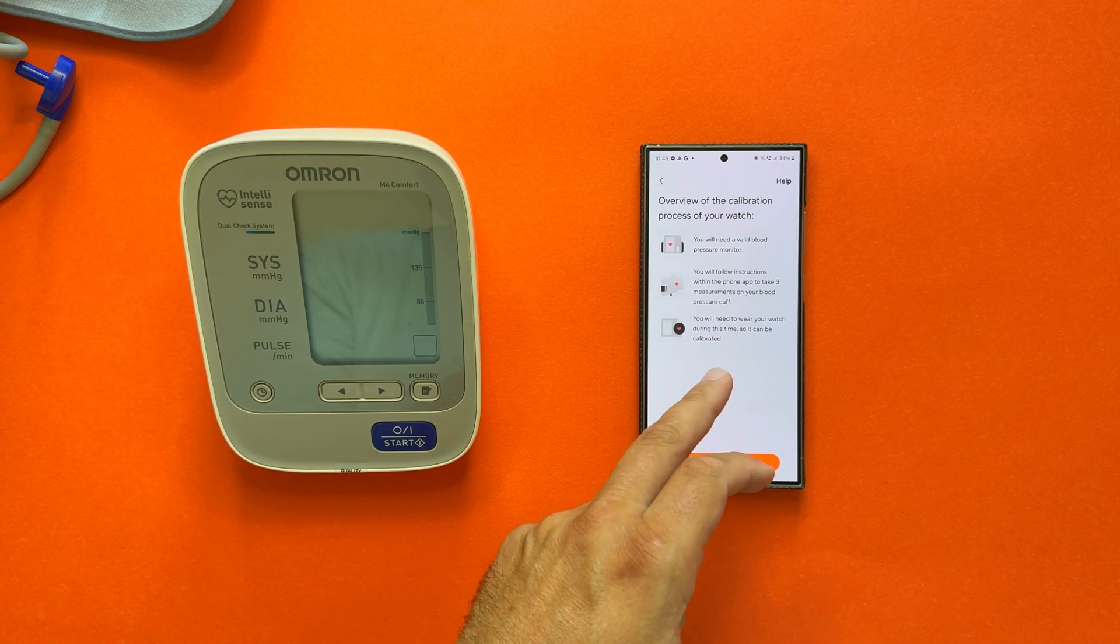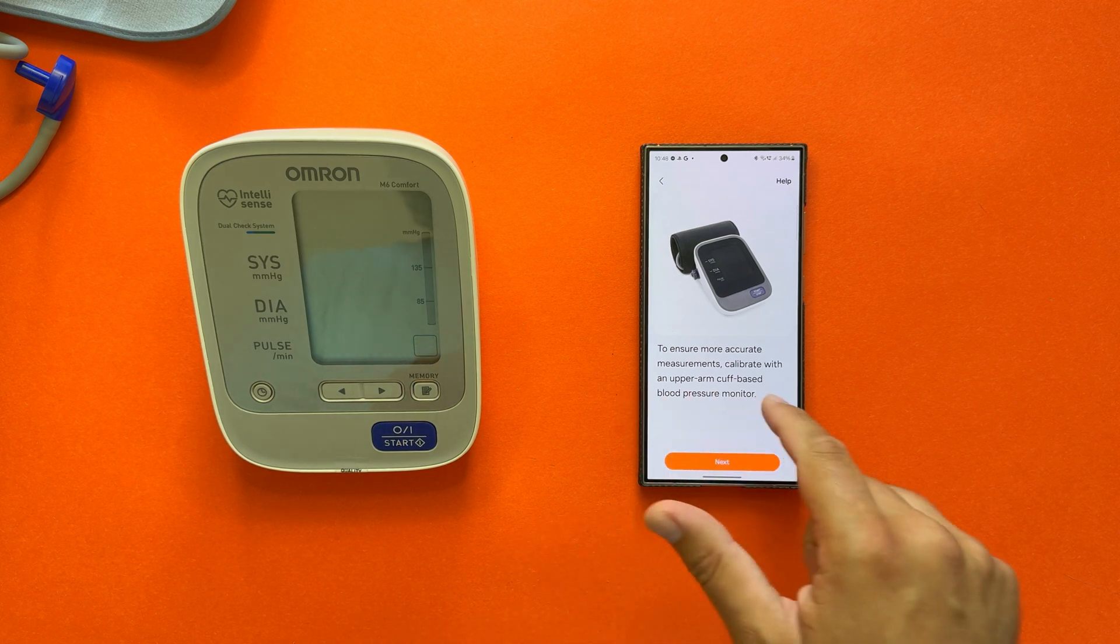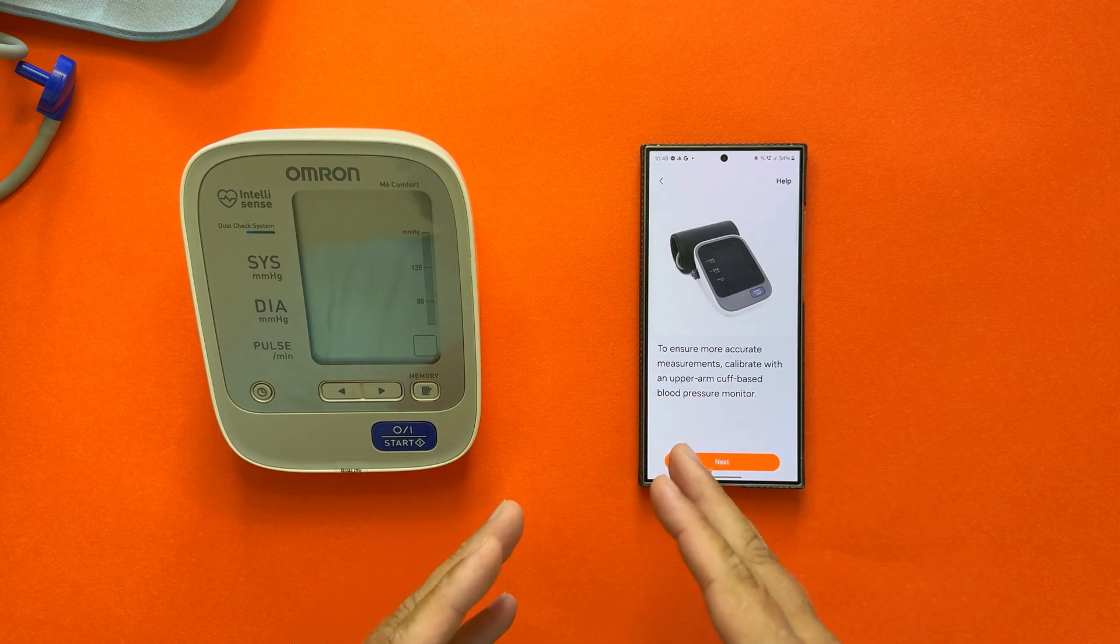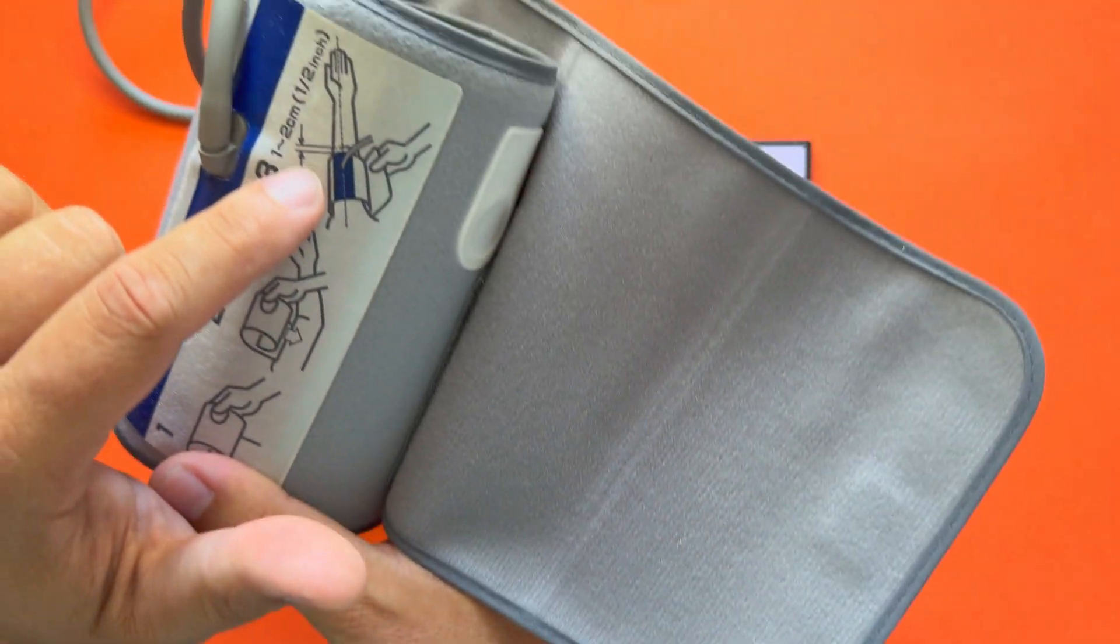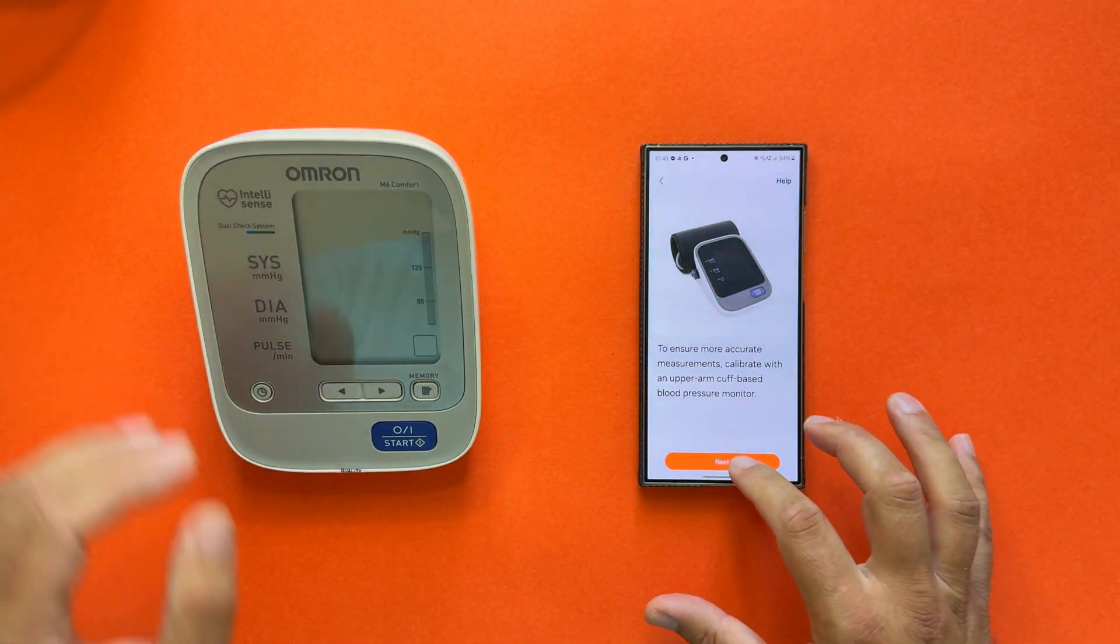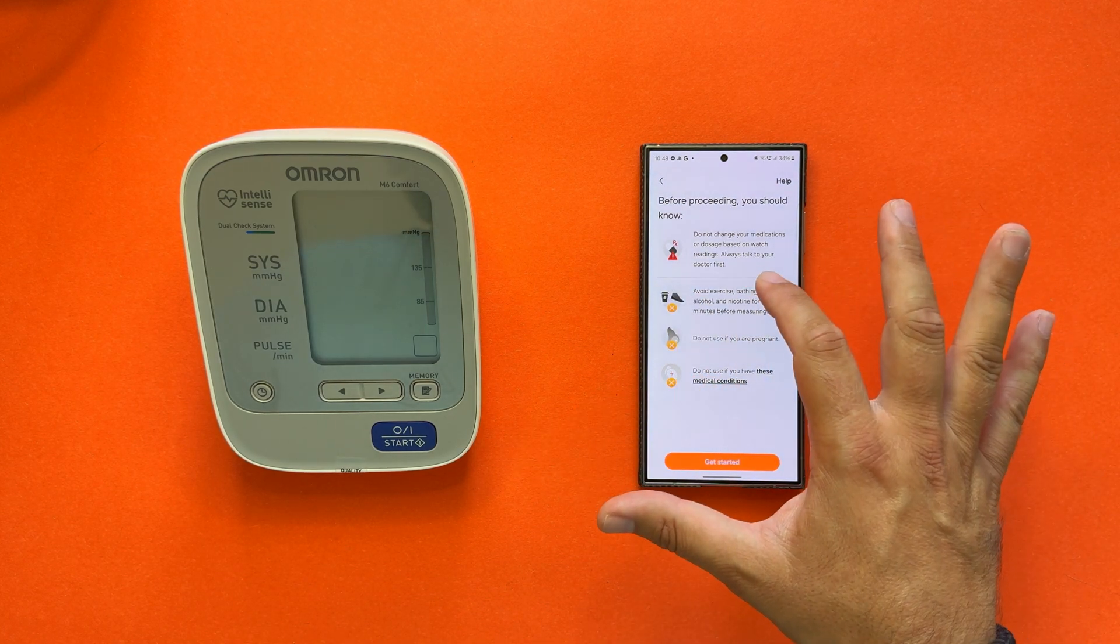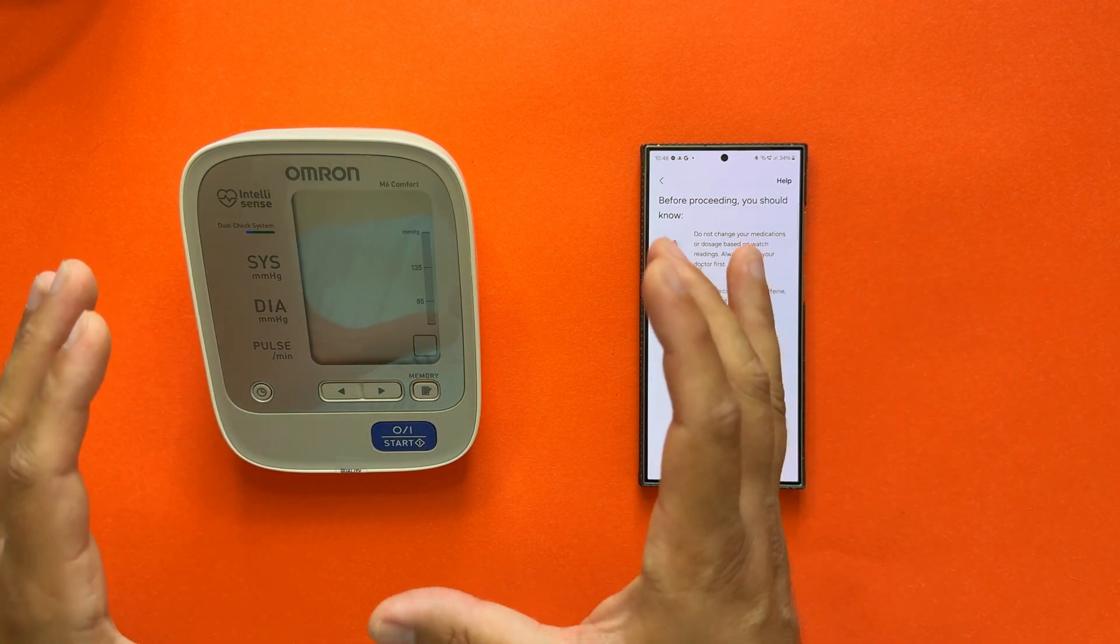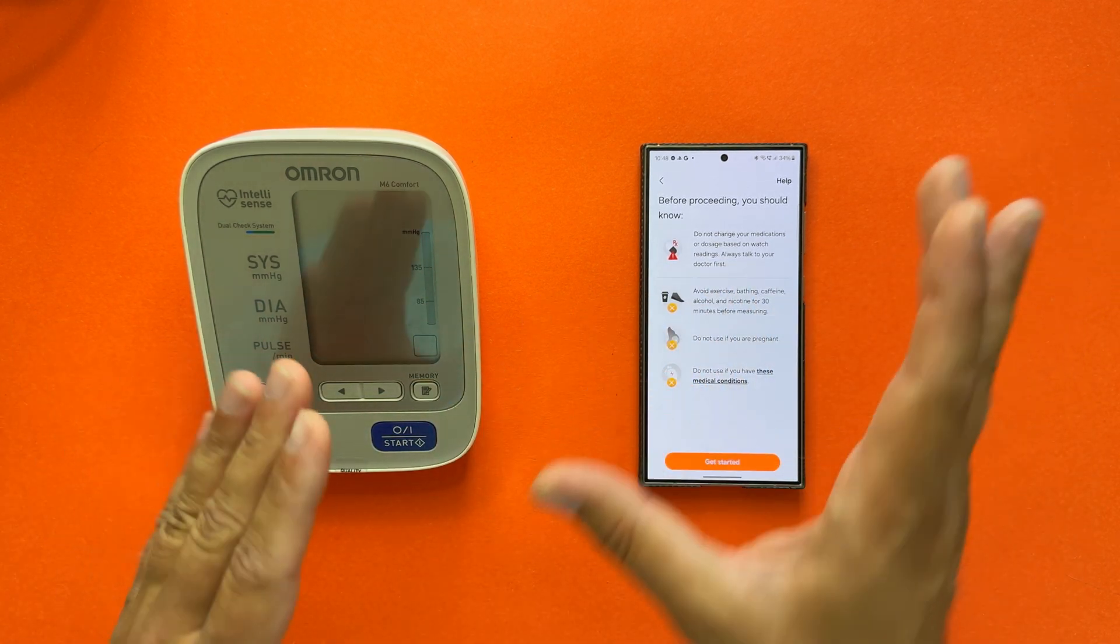You'll need to wear your watch during this time so it can be calibrated. Now I'm going to press Next. To ensure more accurate measurements, calibrate with an upper arm cuff-based blood pressure monitor. This is it, this thing that I'm going to attach to my arm. This is really the best results possible. Now I'm going to press Next. Do not change your medication or dosage based on what you see. This is very important—whatever you do with this, if you want to change something, always please always go and consult the doctor or physician.